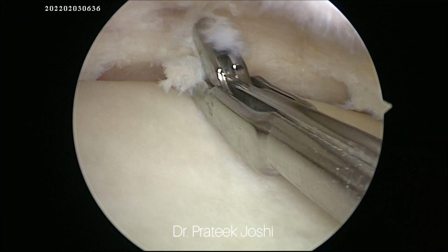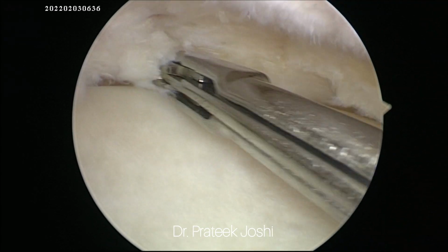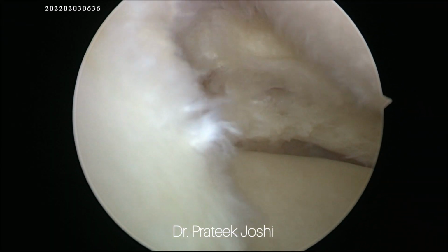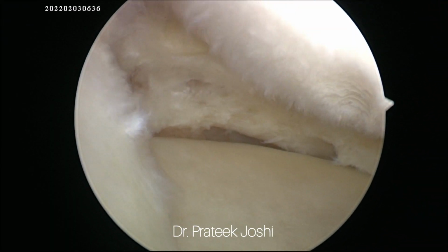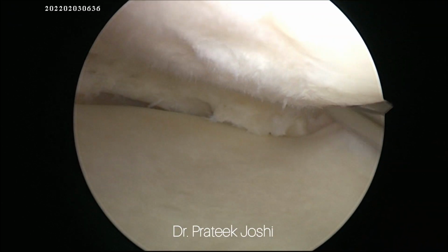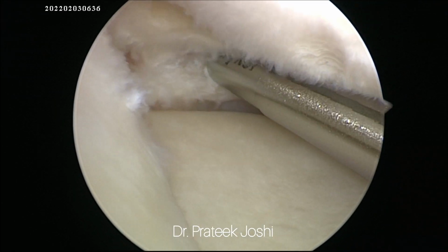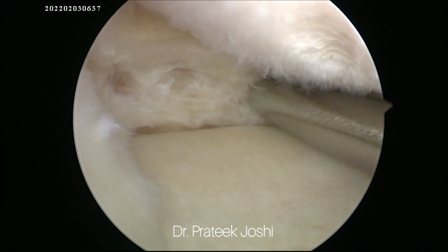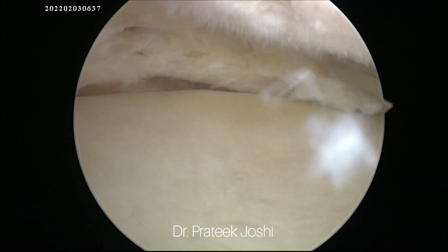It is mainly a horizontal tear involving the posterior horn of the medial meniscus. However, as we go towards the body, there is a component of oblique tear, so this makes it a complex tear. So after using the arthroscopic punch, I am going to introduce the arthroscopic shaver to take out all the loose debris of the torn medial meniscus. And once we do this, we are going to repair this tear with the help of an all inside device.